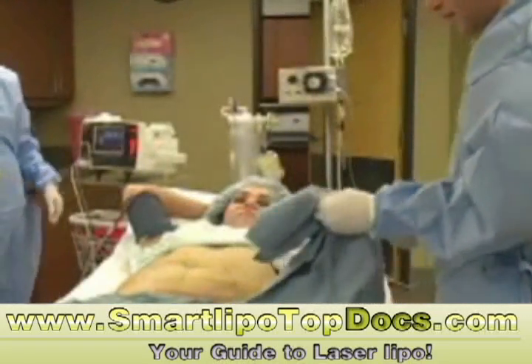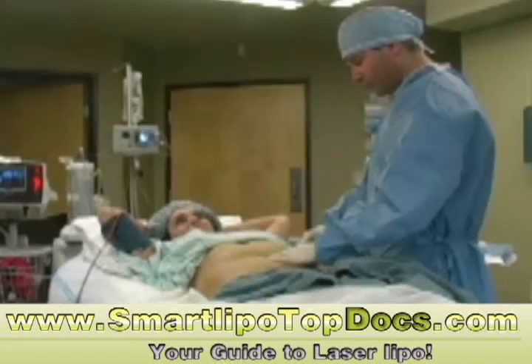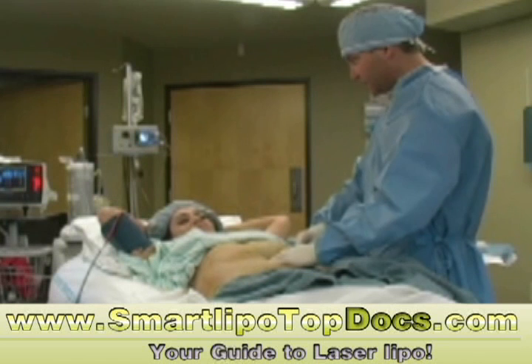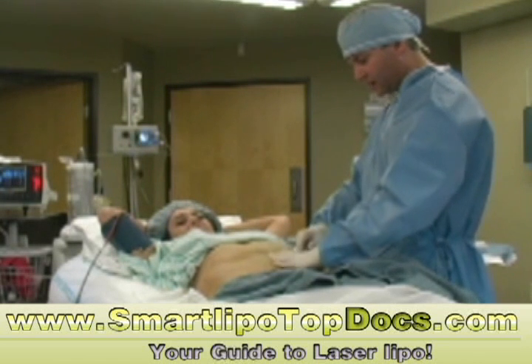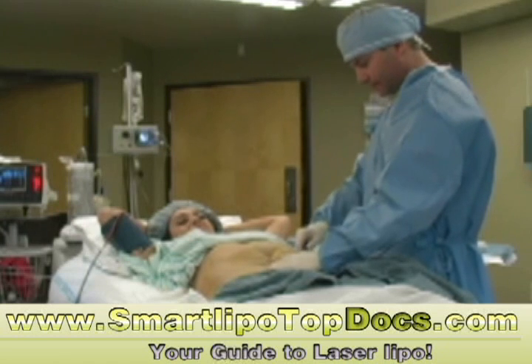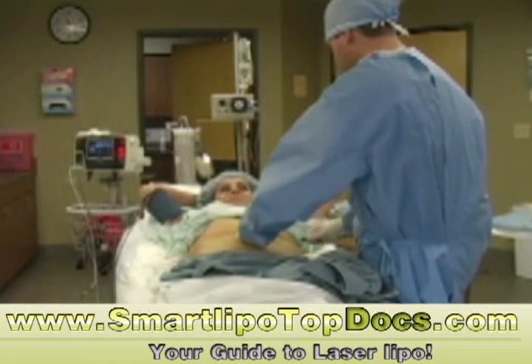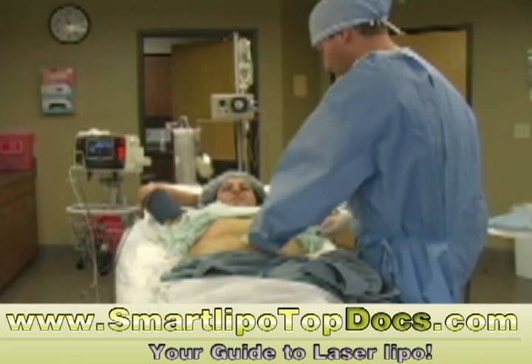Yolanda, now we're ready to start the suctioning process. You'll just feel a little pressure as we're removing the fat, and it's going to be going right into that canister behind you. Even easier than putting in the anesthesia, huh? Yeah, that's a good thing. It's fine — yeah, it's good.